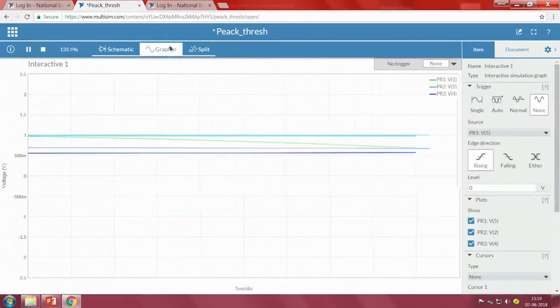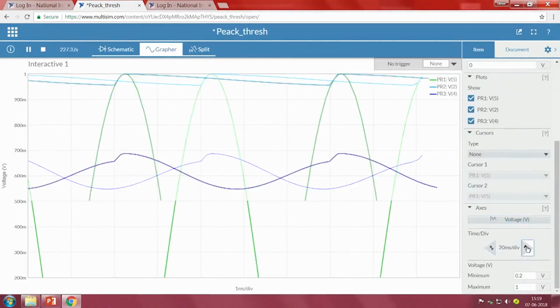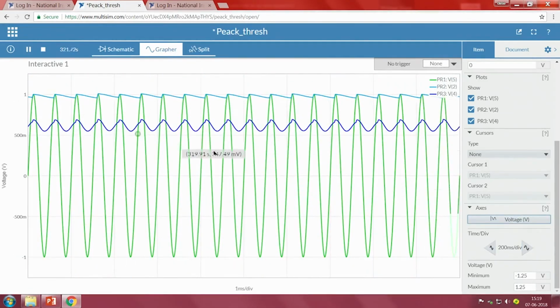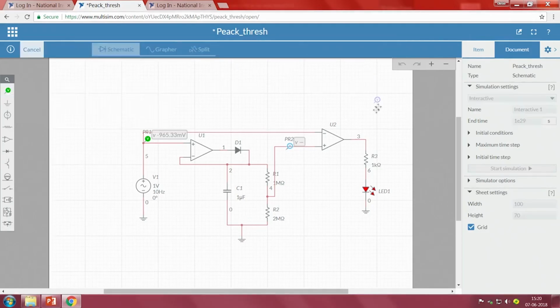Okay, go to grapher, and here let me increase the time division just to understand. So, what is happening here, that we have to understand. Now, we have not connected a voltage source here. So, let me remove everything. I will take one more voltage source, connect at this point, okay. I will take one more voltage source, connect at this point.